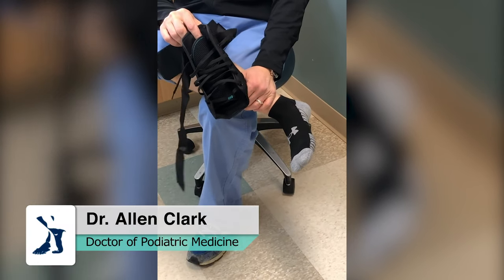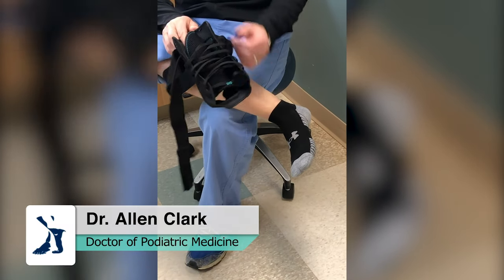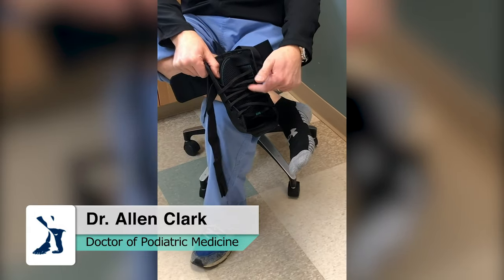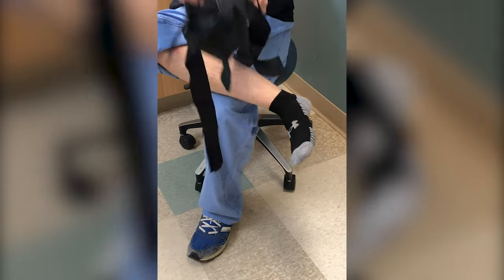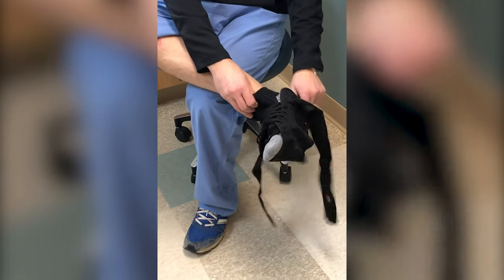We're going to demonstrate how to put on an EVO ankle brace. First off, make sure the laces are very loose. You don't have to go through the top ones just yet, so that makes it easy for you to put it on your foot.